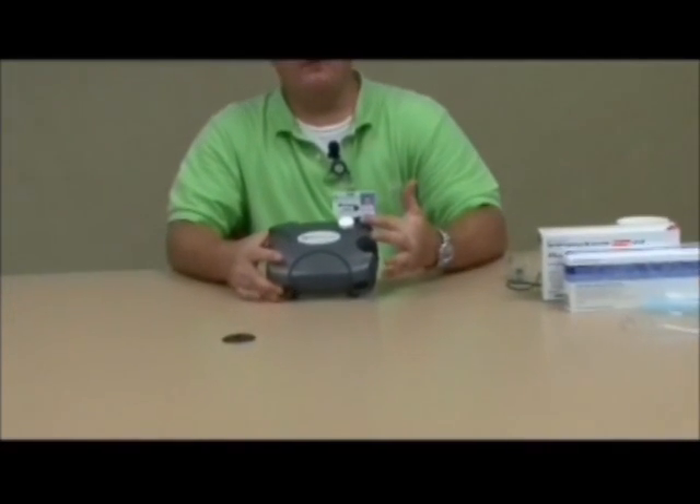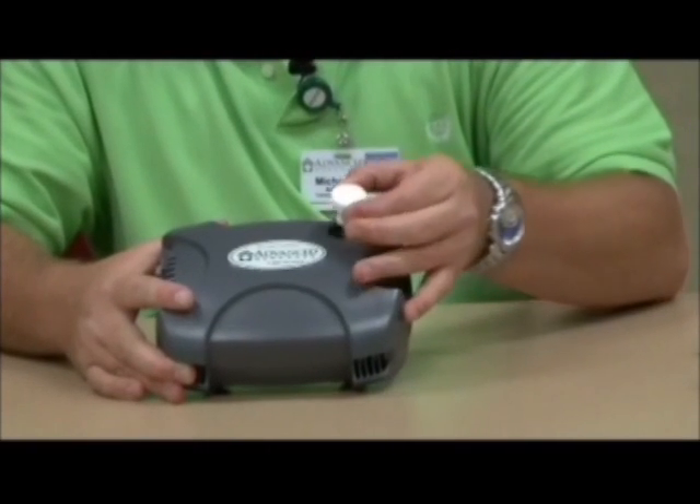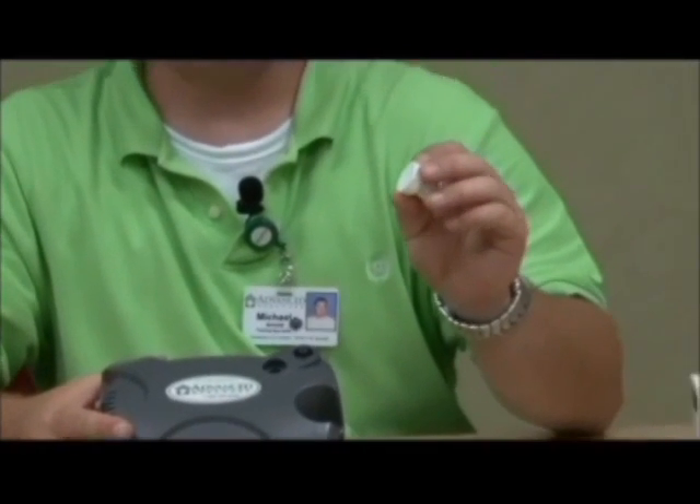Now I'd like to talk to you about your nebulizer compressor. There is a filter located right beside the nipple adapter where you attach the tubing for the nebulizer kit. It's very important that you check this every so often and make sure that it's not discolored. If it is discolored, it will need to be thrown away. This filter is not reusable or washable.